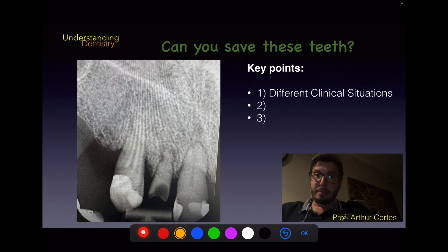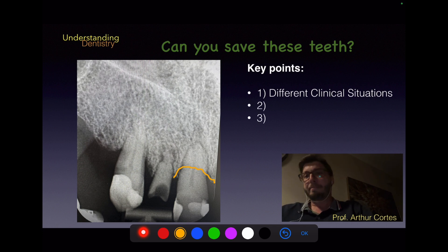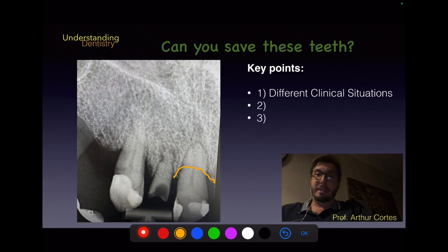Let's analyze the alveolar bone levels. Sometimes two lines are visible because of the buccal and palatal plates, but the levels are usually similar. The marginal bone level is at the middle third of this root — we need to take this into consideration in our decision-making.